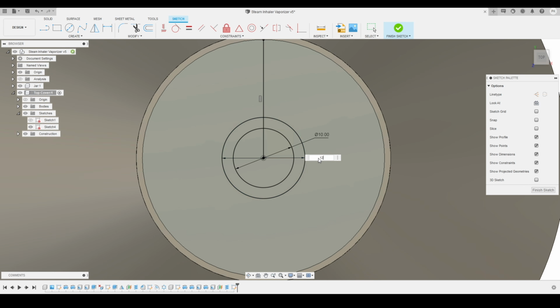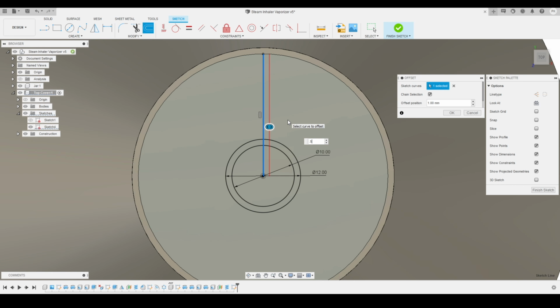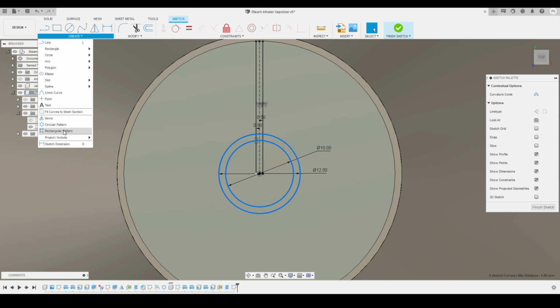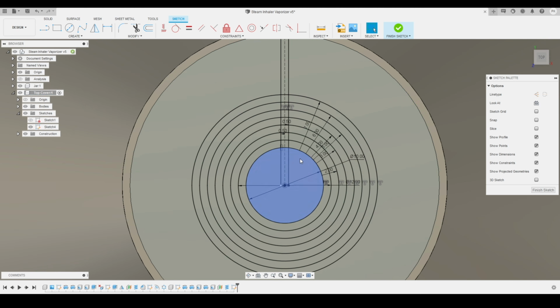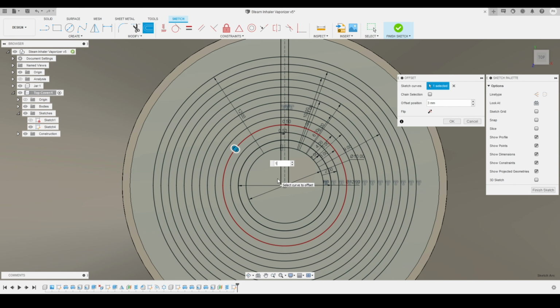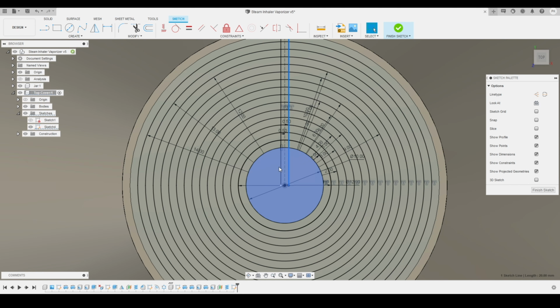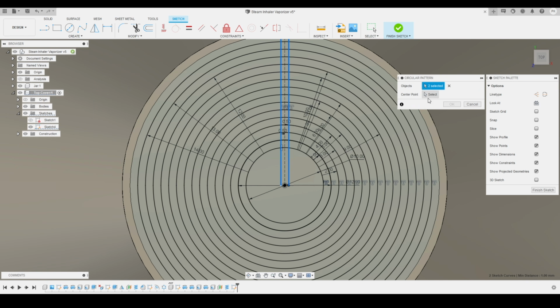Then I will keep creating lots of circles, because there is no way to do all these circles automatically, so I had to do it manually. So here you can see I have created all the circles. Now I will select these two lines, move to the create panel over here, activate the circular pattern tool, and select these two lines along this center, 6 number of times, or maybe 8 number of times, and press OK.